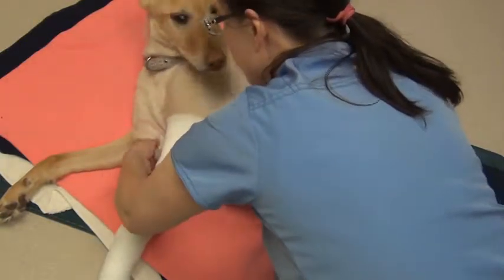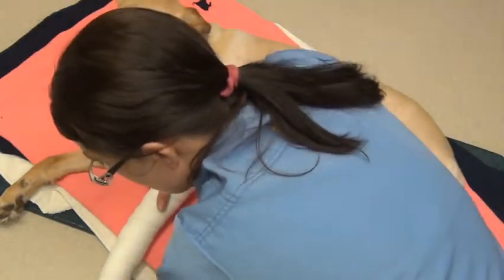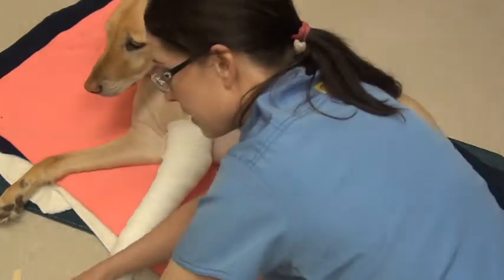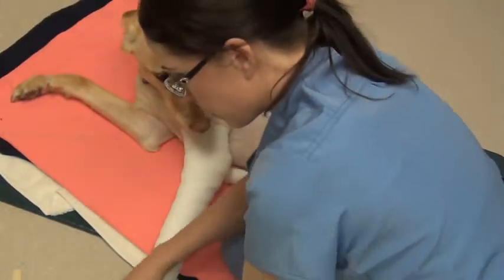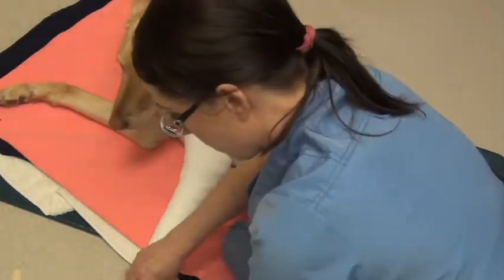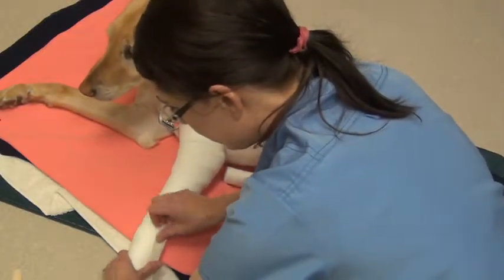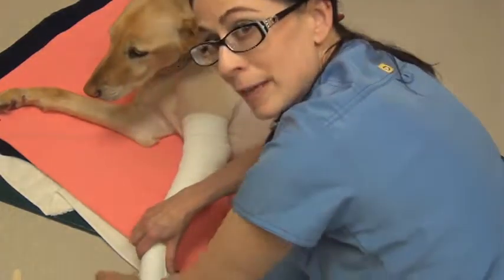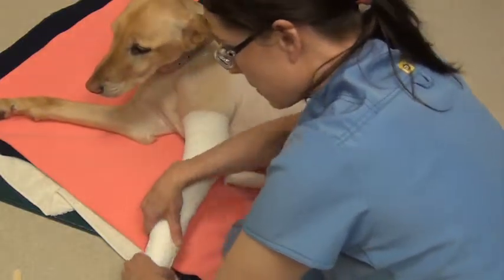Alright, so that portion's ready. Nice and padded. I'm going to go ahead and detach my tongue depressors so I can move my stirrups onto the leg. That's going to keep my bandage from slipping down. It's okay, sweet girl. Alright, here we go. We're just going to twist these around and lay it up onto the leg. As I said, these are a little short, but this is my first bandage. My first Robert Jones bandage.